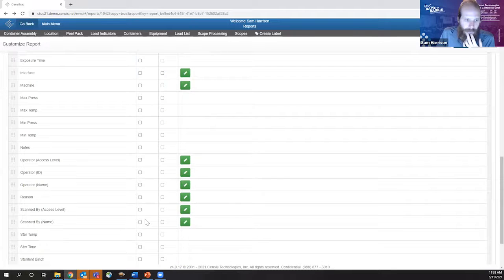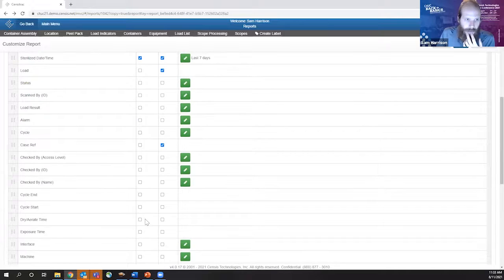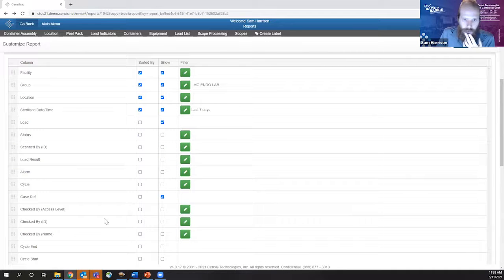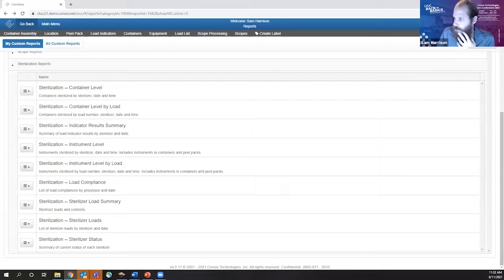I'm not seeing it. Kelly, do you see if I'm missing something here? So there, that report might exist, Garrett. I would have to spend a little more time looking through these reports and trying to figure that out.